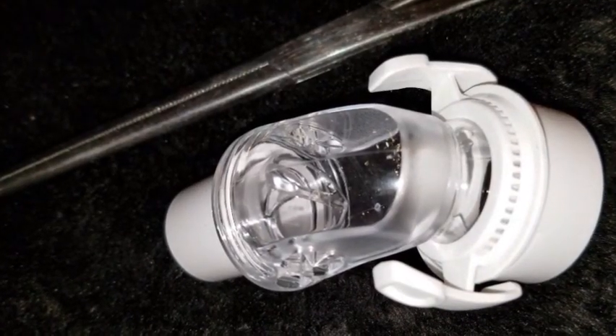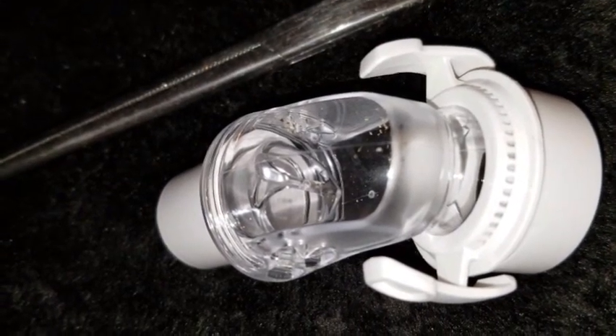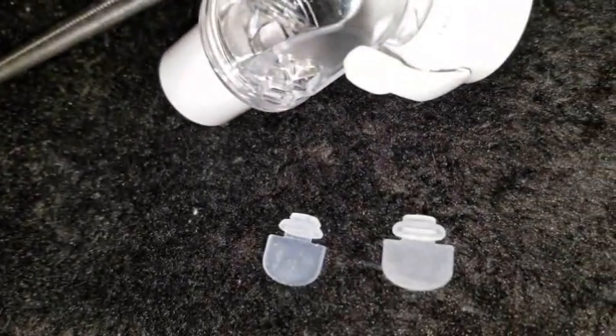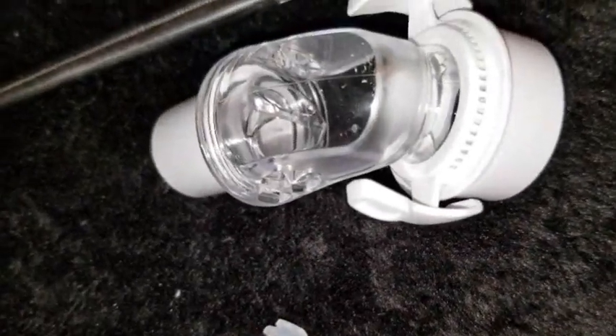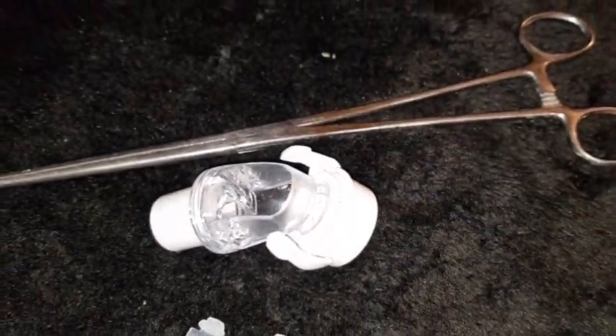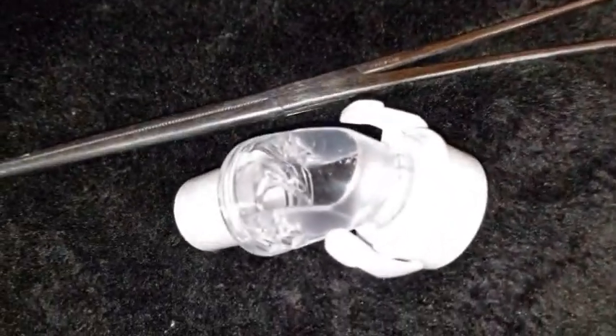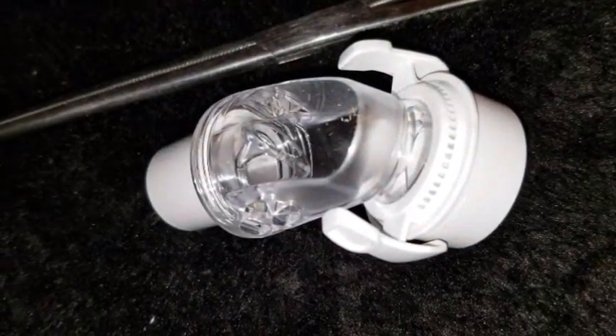If you look inside the elbow, you'll see that I got rid of those silicone flaps — and there they are right there, so they're not going to be blocking the way. What I did is I just reached in with these forceps on both ends and pulled them out. Easy.